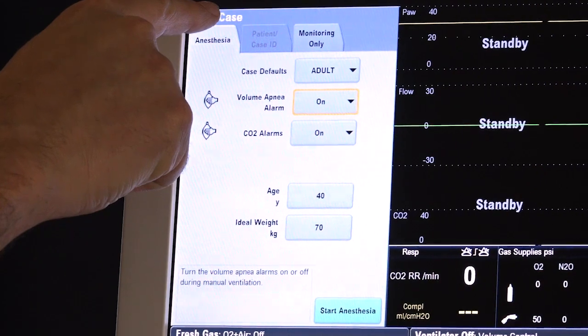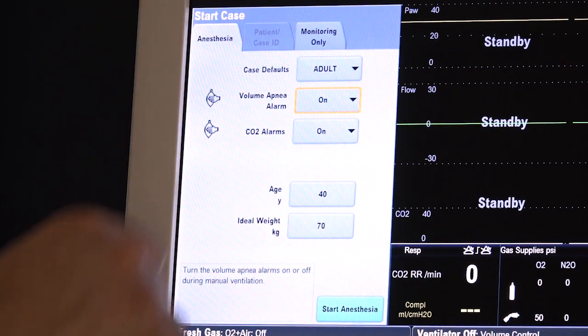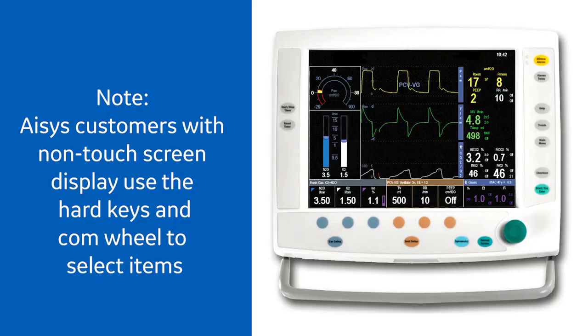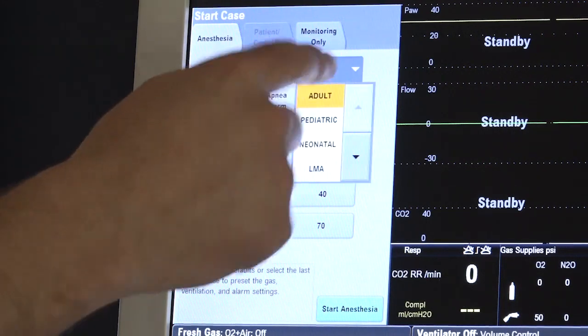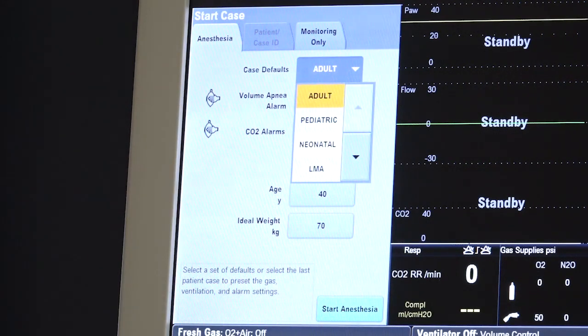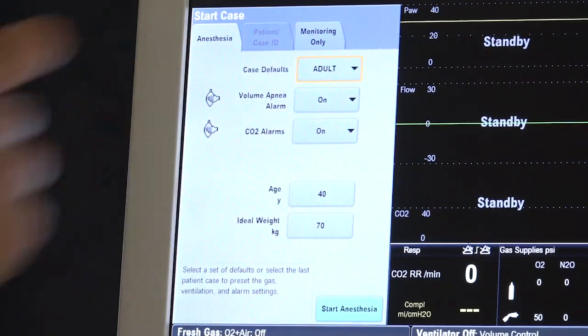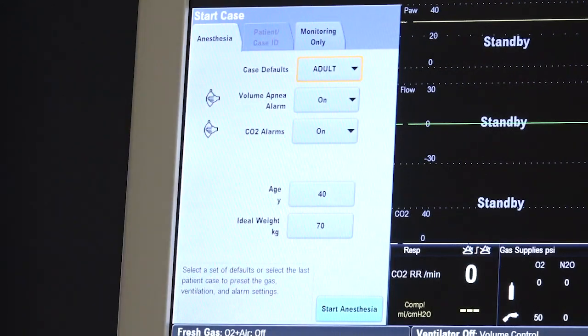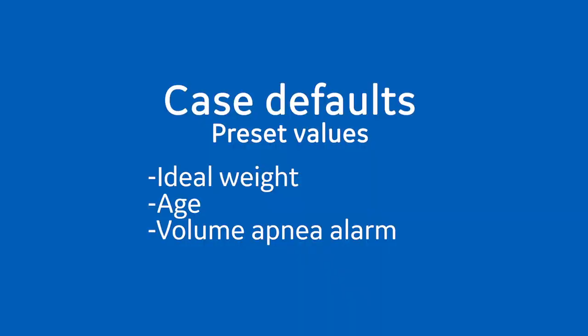Use the start case menu to set the case data and start the gas flow. A case can be started using default or custom settings. The case default selection shows the four default case types and the ability to use your last case setting. Each case type has a preset value for ideal weight, age and volume apnea alarm.